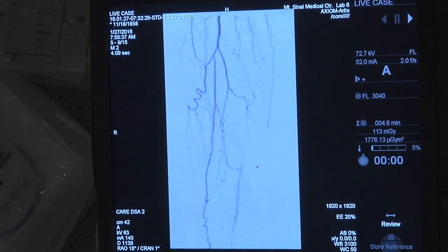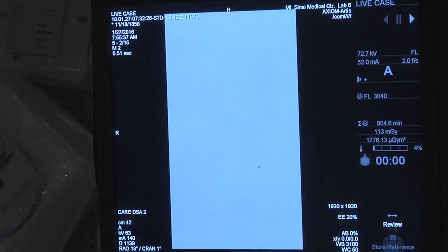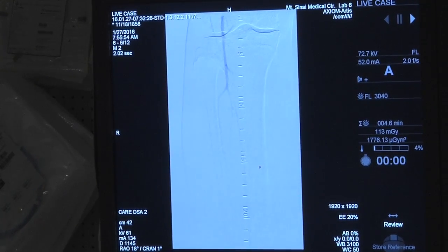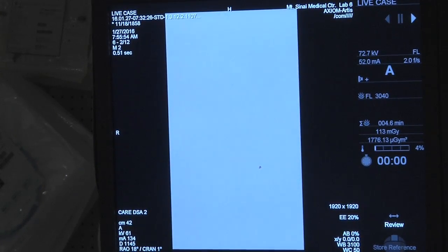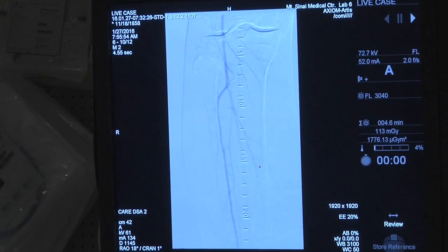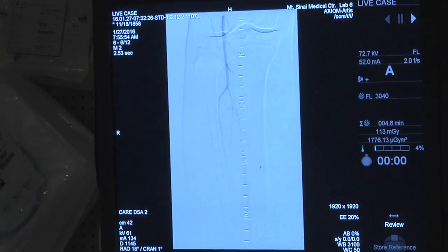Here's the distal SFA. And again, you'll see delayed filling of different areas of the SFA, suggesting that you have occlusive, subtotal occlusions with areas of hibernation, with areas of total occlusion, suggesting that thrombus is going to play a role within your intervention. Now you can see with runoff, she has single vessel runoff. So what I want all of you at home, when you see this, is to immediately understand that you're going to be dealing with thrombus when you're dealing with this type of case.